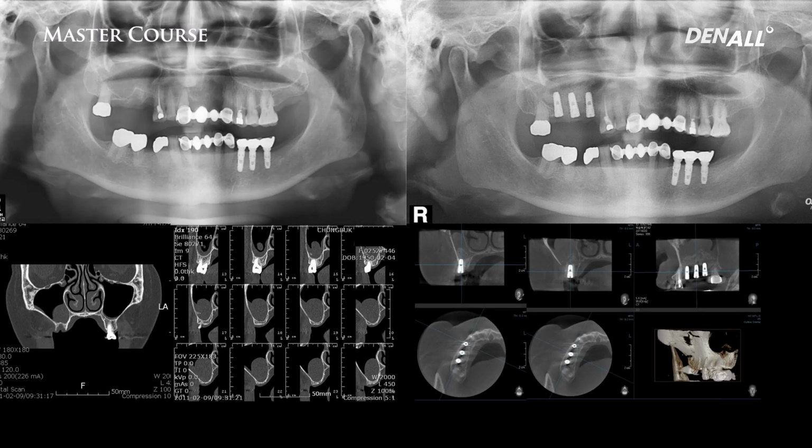On the left side, this is before surgery. As shown, there is dome-shaped mucus retention cyst. On the right, this is cone beam CT. Implant has been placed. Bone graft is done. On top of it, there is still a bit of cyst left. If possible, I'm going to show you a surgical clip of doing surgery in relation with mucosal retention cyst.